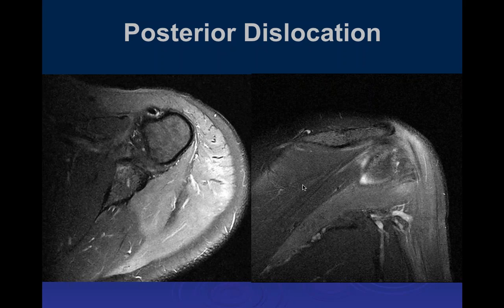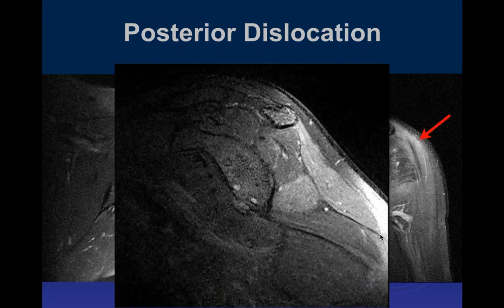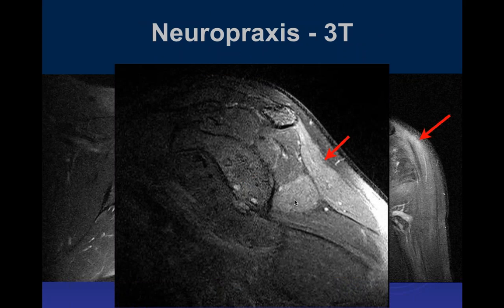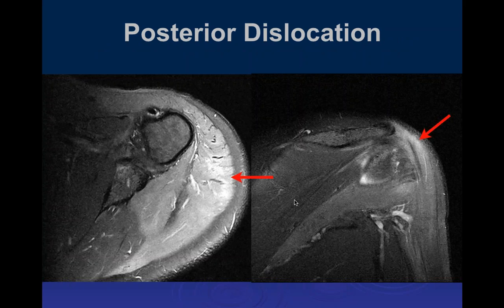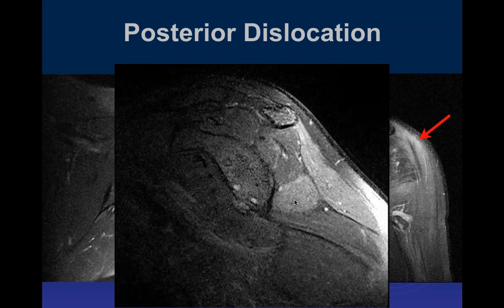muscle edema within the teres minor or infraspinatus? Teres minor and in the deltoid. So with posterior dislocation, be concerned for denervation injury of the axillary nerve. And how does the axillary nerve enter that area? From the quadrilateral space? There you go. I knew you knew that. That's why I asked it.